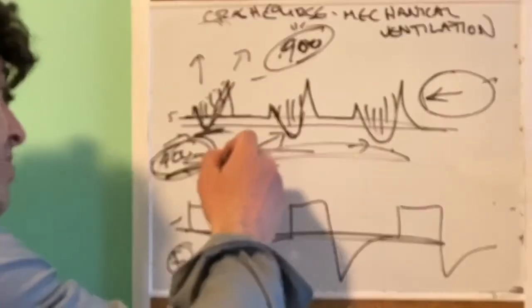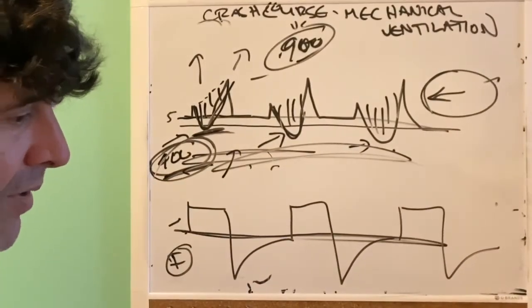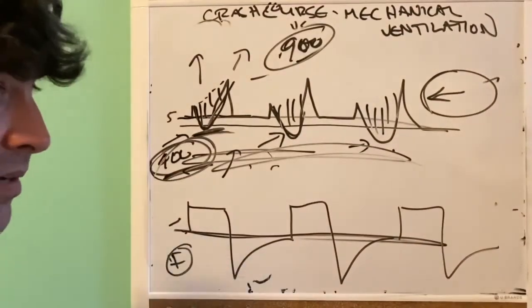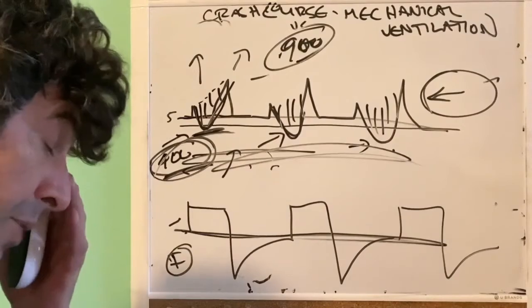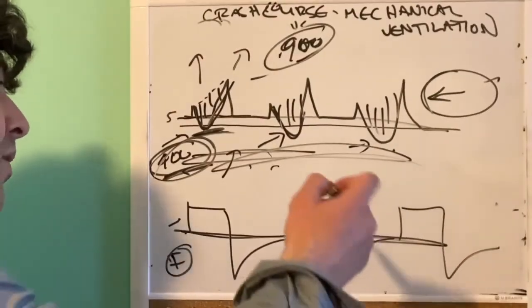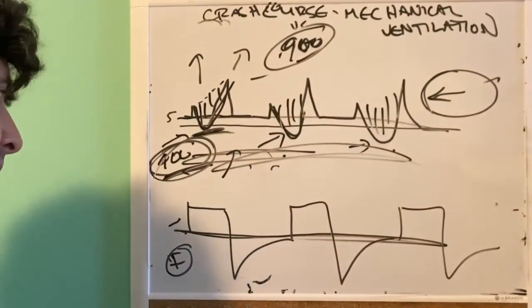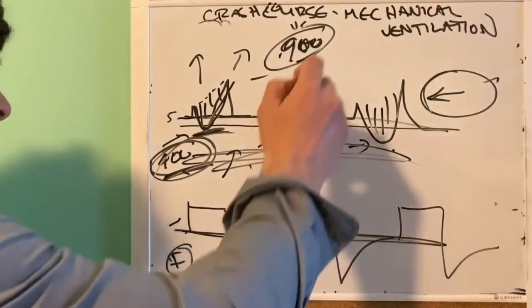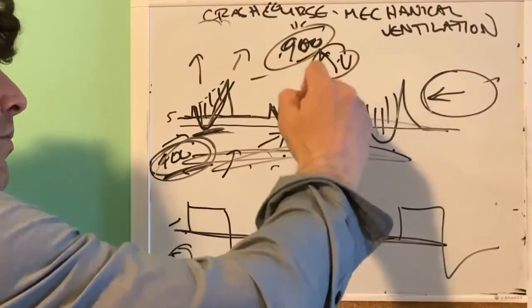For example, if this patient has no pulmonary disease, doesn't have ARDS, and is intubated because of a subarachnoid hemorrhage, you may say, I want to follow his mental status. His mental status may determine whether he goes to the operating room or not for some conditions. You might say, forget it, I don't want to mess up his sleep-wake cycle, mess up his neurostatus, increase delirium in this neuro condition, so I'm going to move the volume up to 900.